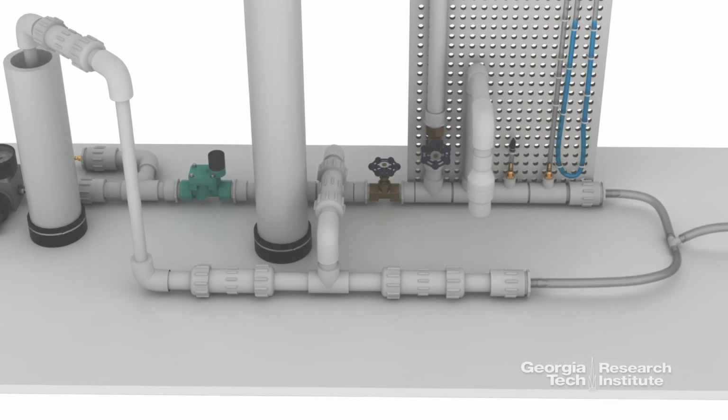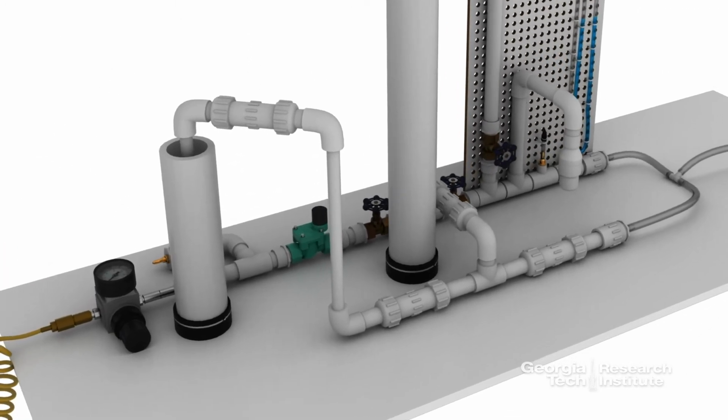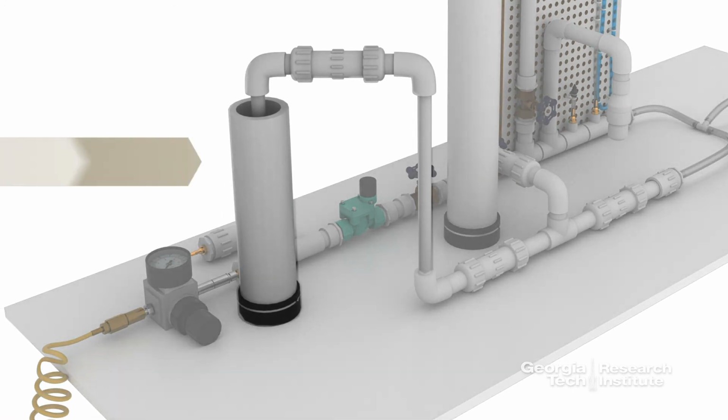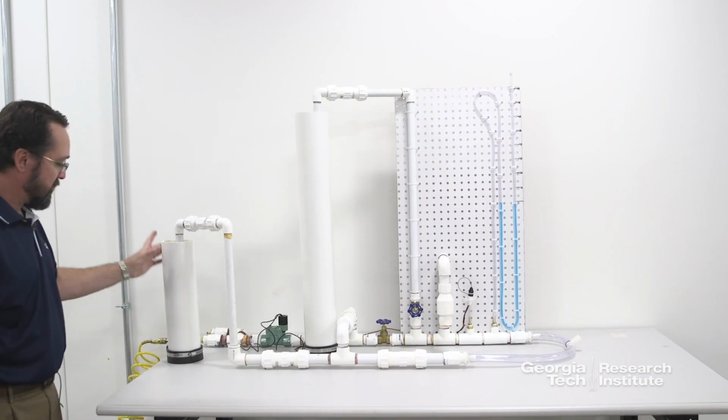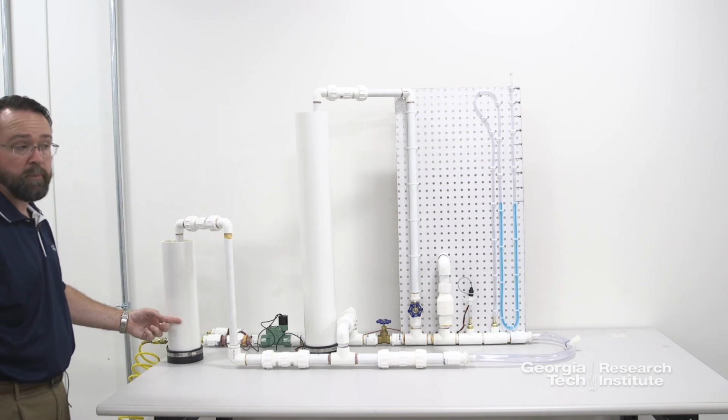The final stage in the exhale path is a PEEP valve. What this does is maintain a certain amount of pressure in the lungs. It doesn't allow the pressure in the lungs to go down to 0. And you set this the same way. There's a column of water here. This tube is inserted in that column of water by some amount. 10 centimeters is what we're going to show you how to do.